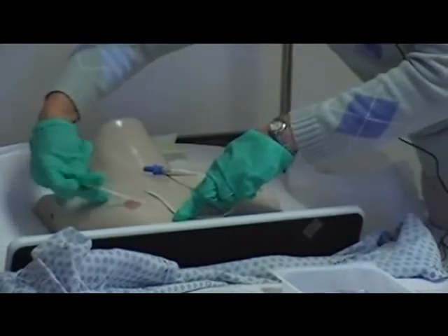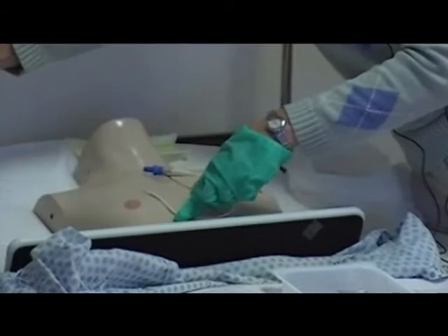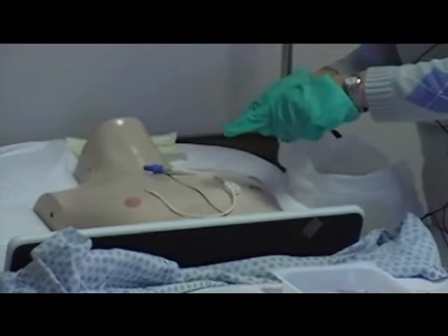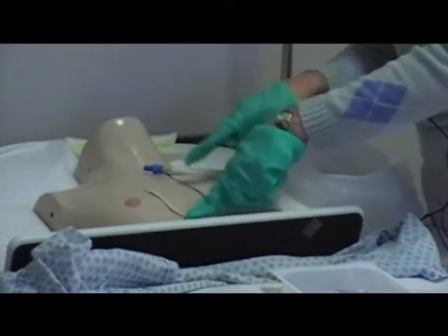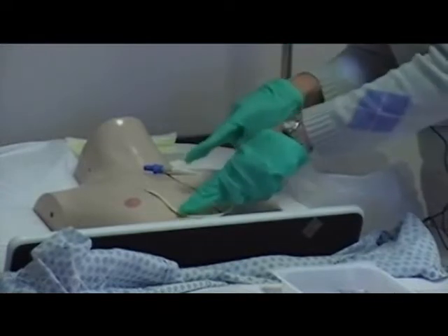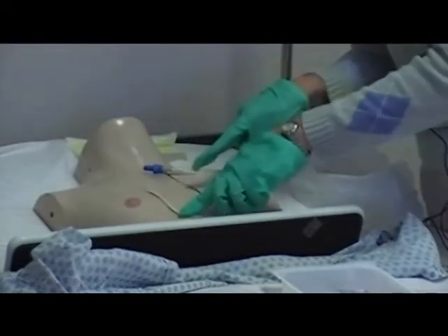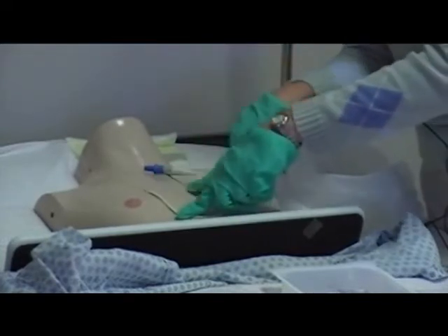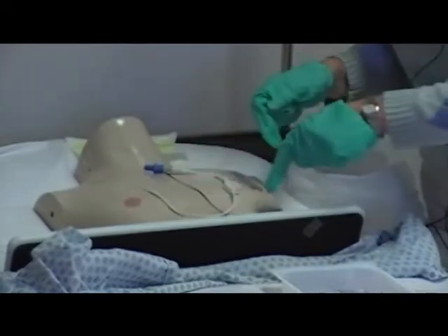Now, as you notice, the dressing kind of tore a little bit on me as I took it off. I've never had that happen in real life. If you've got one that is sticking very, very hard, you can take alcohol and work it along there as you are loosening your dressing. That will help remove it. And if you pull on their skin a little bit, that will also help. A mannequin doesn't have skin that's movable.